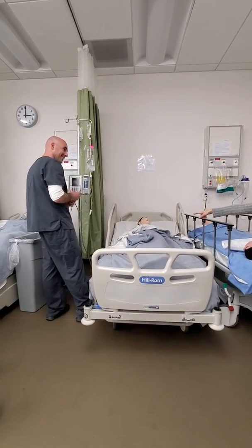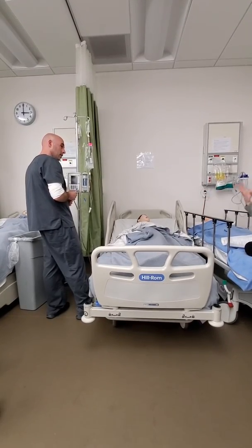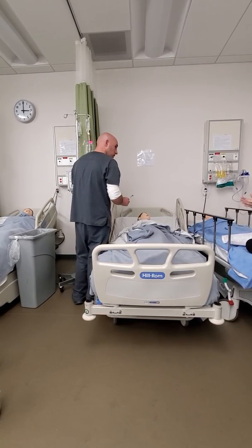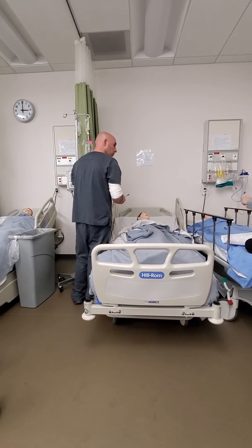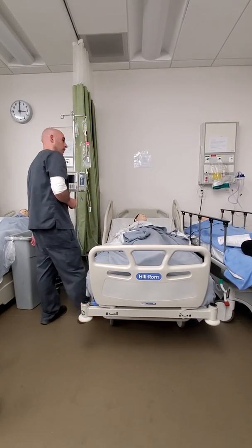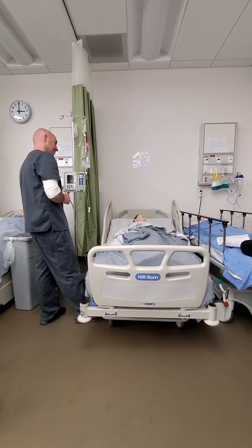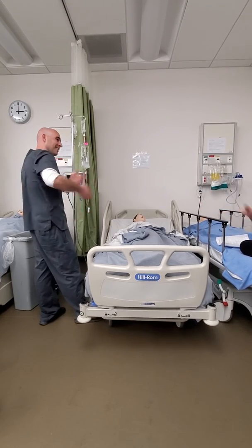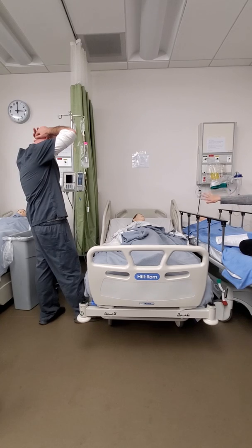If you just lay it next to her, that way you have your hands free to do the cleaning and the push pause. Leave the syringe attached. Then you can pick up that and then disconnect and connect. That way you're not trying to hold on to that while you're flushing the line and everything. Okay. It just saves steps. It's not that you did it wrong, it's just quicker that way. And you almost forgot to hook her up, so it's nice to do it all at once.